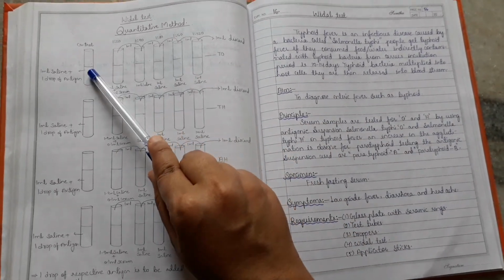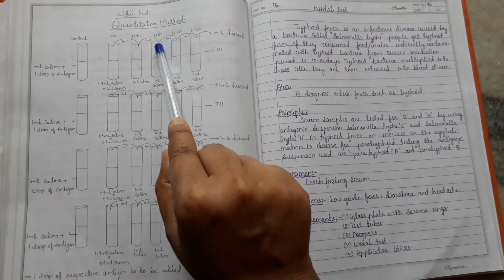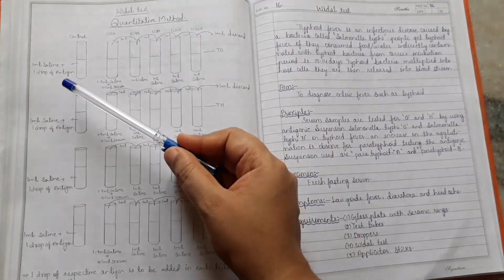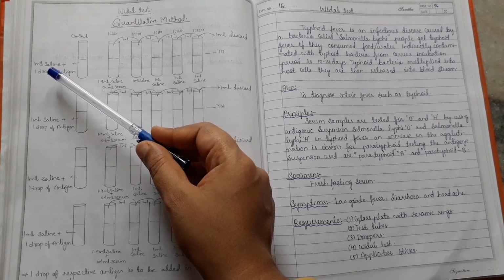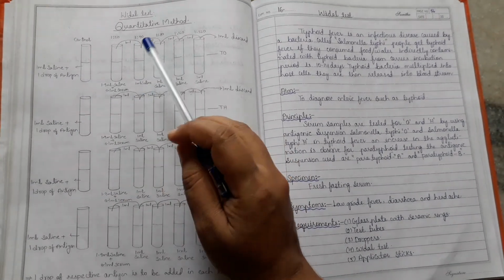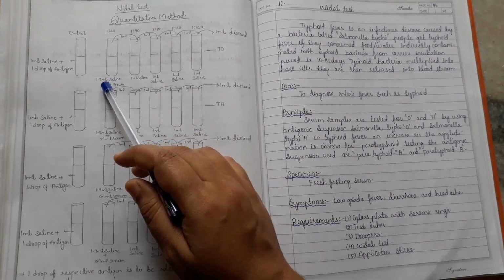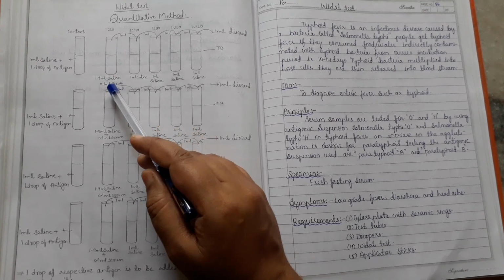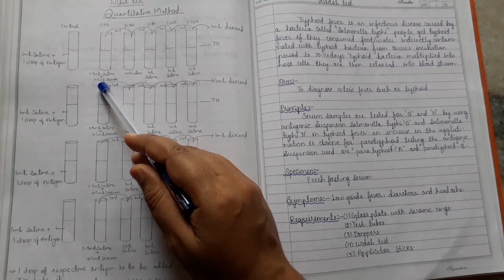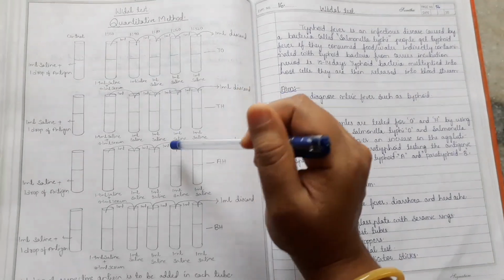This is the control and these are the dilution titers: 1 in 20, 1 in 40, 1 in 80, 1 in 160 and 1 in 320. For the control, 1 ml of saline plus 1 drop of antigen. Coming to the titers, for the first one, 1 in 20 dilution, we take 1.9 ml saline plus 0.1 ml serum. So this is the dilution method.